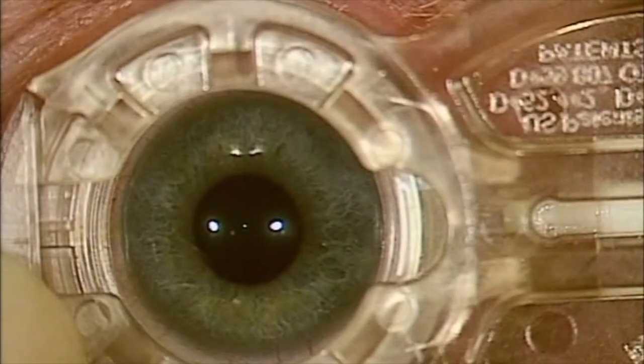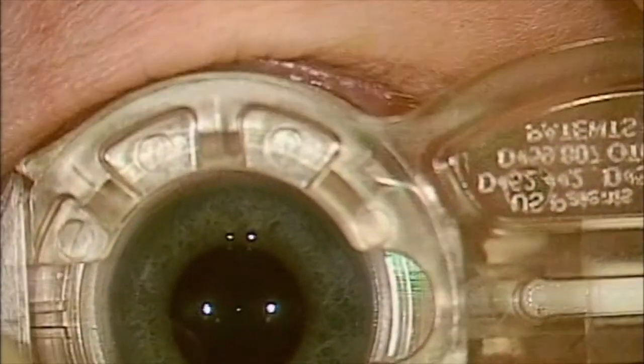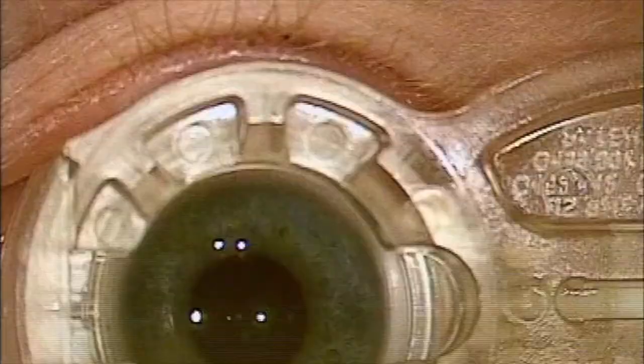You can just see it in the bottom left hand corner there to make sure you've got even apposition before you apply the vacuum, and then you're ready to dock.